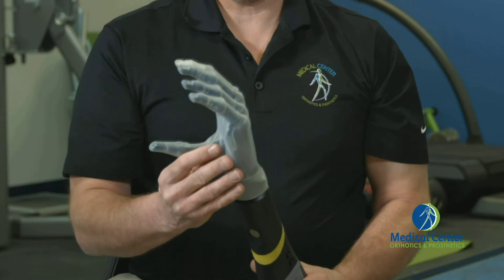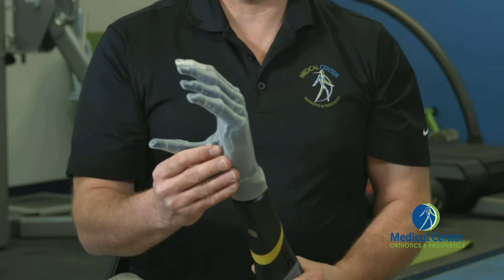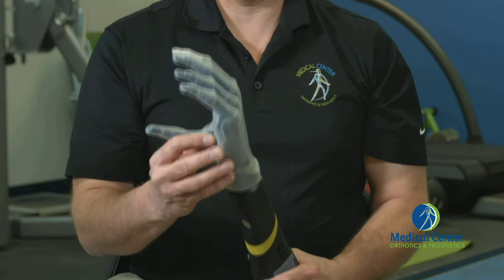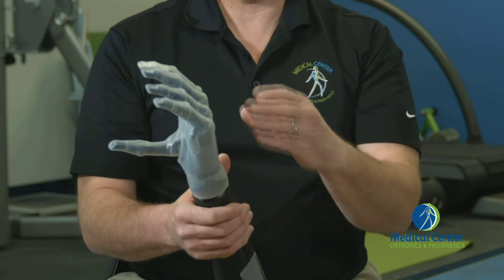The nice thing about this hand is we have 24 pre-programmed hand positions that the user can choose from. We can program four of those hand positions that the patient can use their myoelectric signals to drive into the different hand positions.